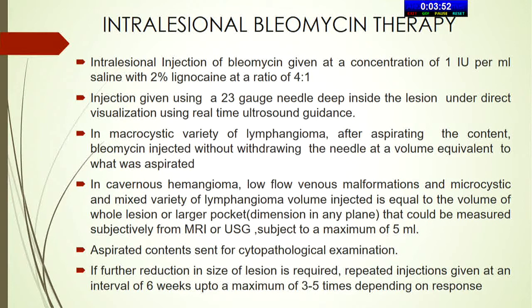In the macrocystic variety, after we aspirate the contents, without withdrawing the needle, we can inject a volume equal to what was aspirated. And we have also tried this in cavernous hemangiomas, low flow venous malformations, and in the microcystic and mixed varieties.